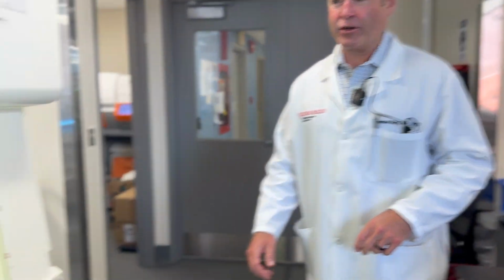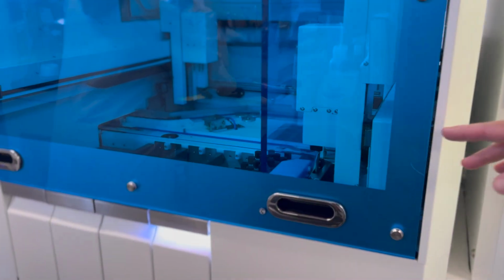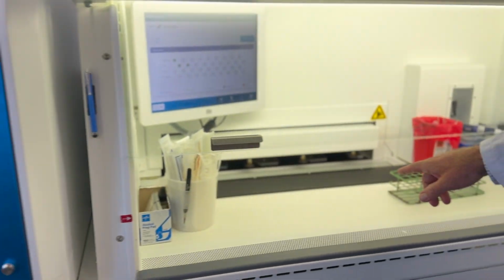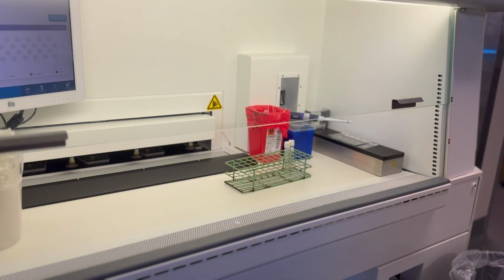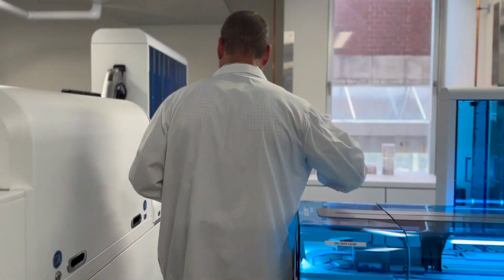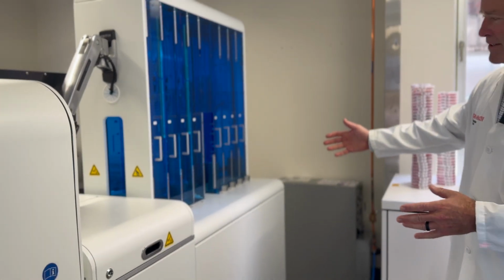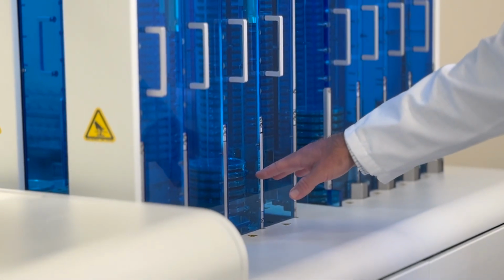In addition to gram staining, specimens are cultured, and the culture process involves pipetting out some of the specimen over here in this instrument, and then automatically streaking the plates on the instrument here. The way that this instrument works is basically it puts the specimen on the plate, it puts a ball bearing on the plate, and then that ball bearing is struck using a magnet to spread the specimen all across the plate so we can isolate colonies. And then if we come on over here, you'll see here on this side of the instrument the plates come out and are stacked here. And once they're stacked here, they're fully inoculated and ready for incubation.